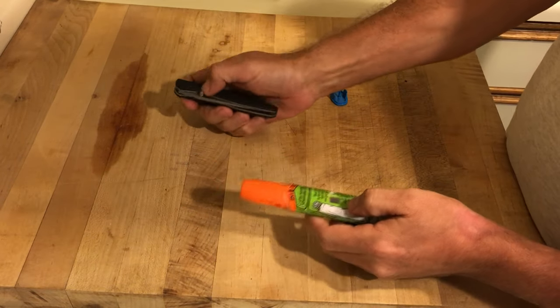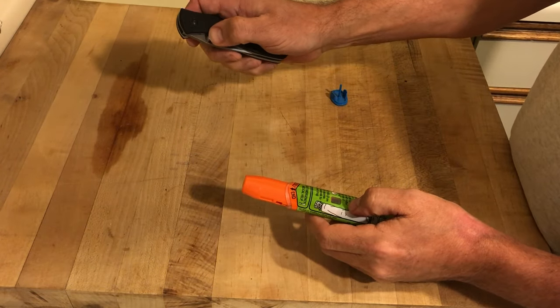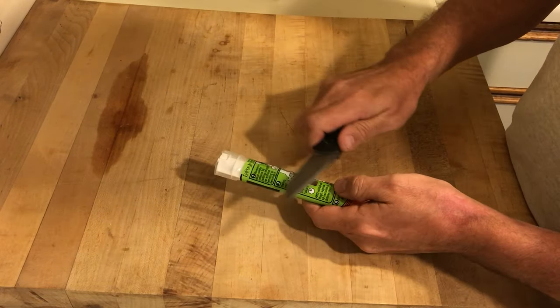So take your pocket knife — preferably a folding knife with a lock — and take off the plastic outer cover.